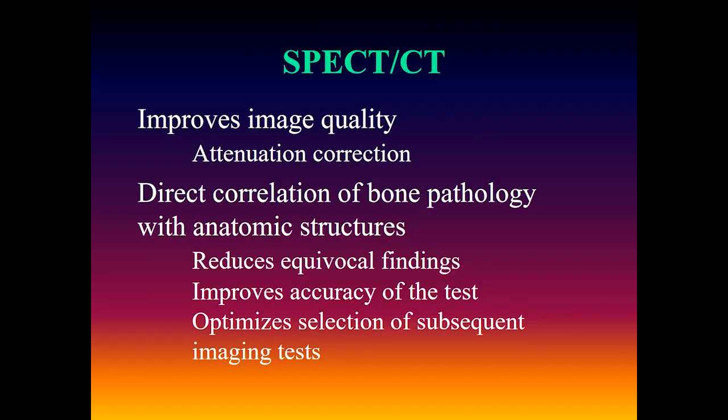SPECT CT offers significant advantages when performing bone scintigraphy, or for that matter, almost any nuclear medicine procedure. Number one, we often don't think about it: it improves image quality merely by virtue of the attenuation correction afforded by the CT component of the examination. SPECT CT provides direct correlation of bone pathology with various anatomic structures, thereby reduces equivocal findings, improves test accuracy, and optimizes the selection of subsequent imaging tests.